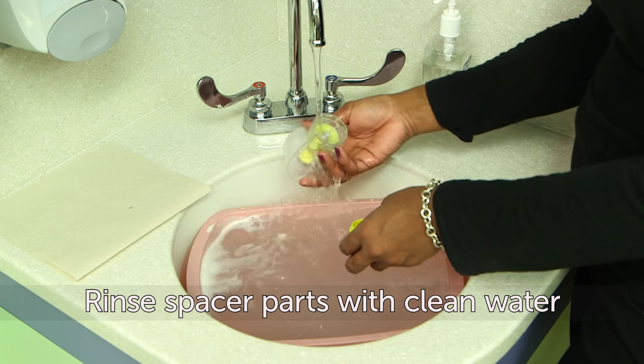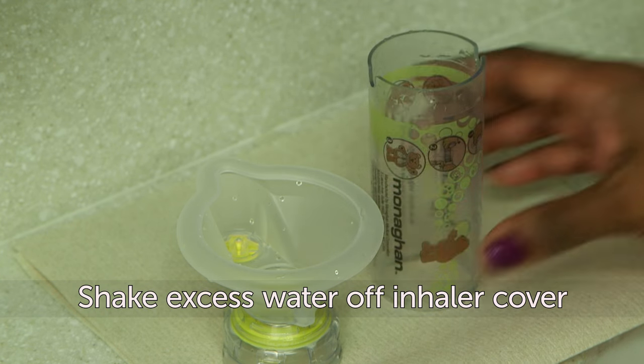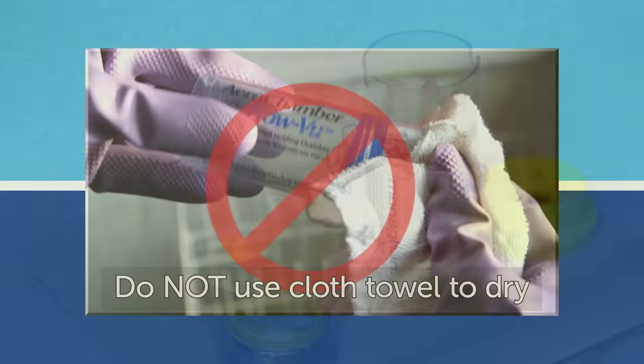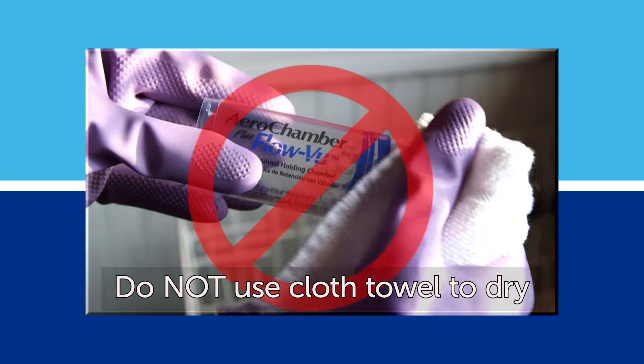Rinse the spacer parts with clean water. Then shake off any excess water from the spacer parts and let them air dry on a clean, dry paper towel. Keep the spacer standing up to dry properly. Do not dry the spacer with a cloth towel, as it may leave lint in the spacer.